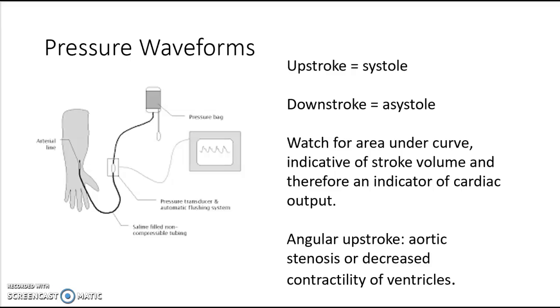So now we get into pressure waveforms. You can get a lot of information from the pressure waveform.